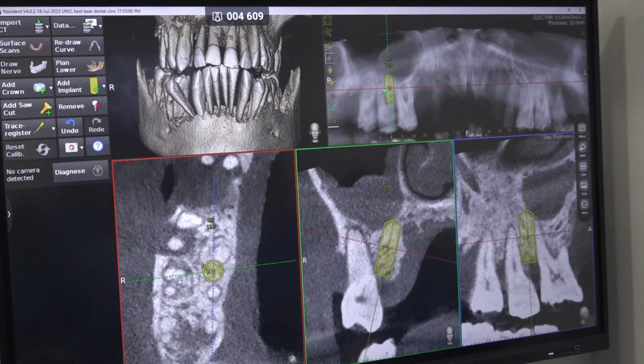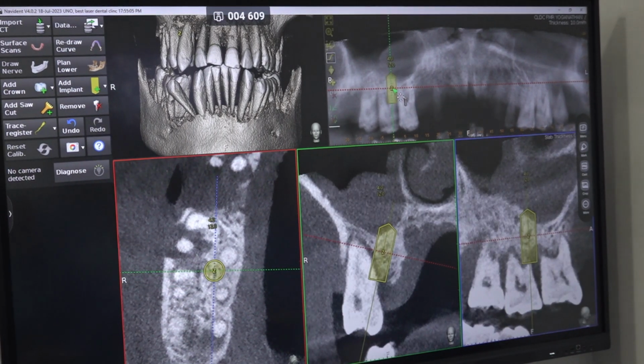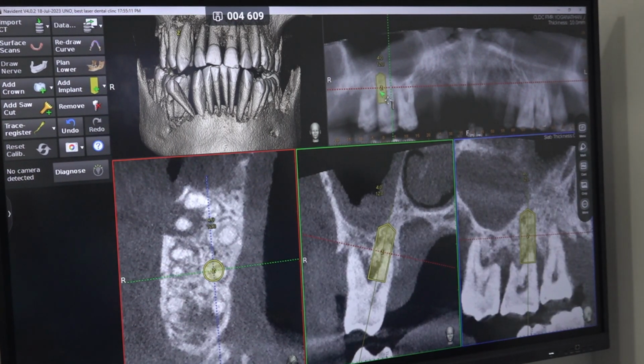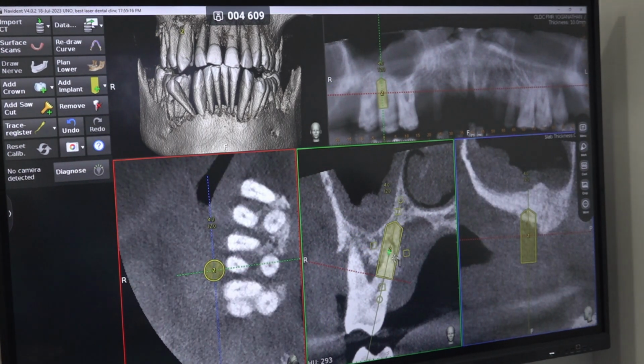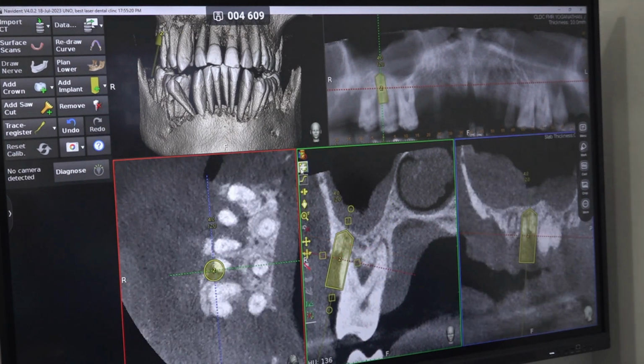Now we are going to see the palatal root of. This is 6 only, right, sir? No, this is 7. Okay, mesial root of 7, mesiobuccal. Now we are seeing the palatal socket of 7. Yeah, this is good, right? This is excellent. More than 6, this root looks promising.